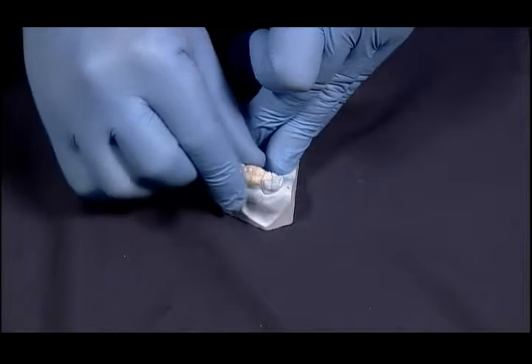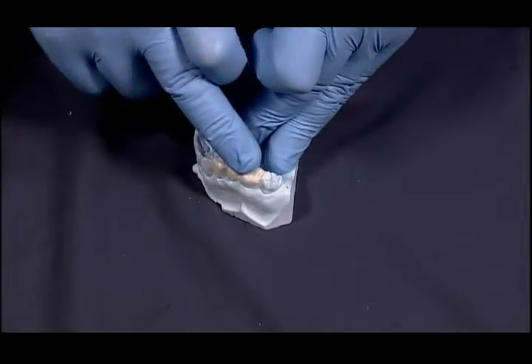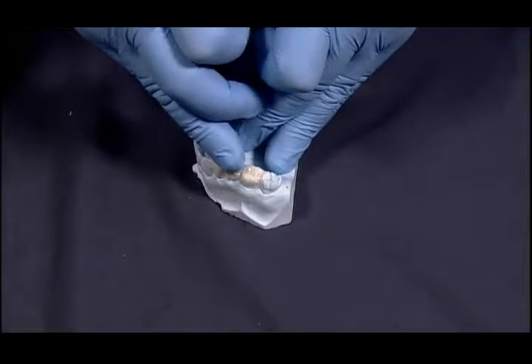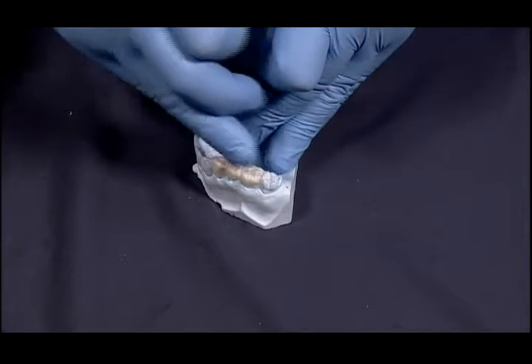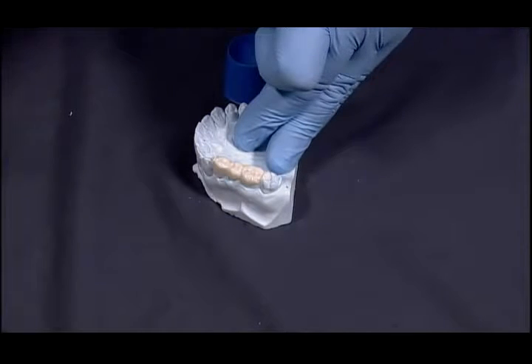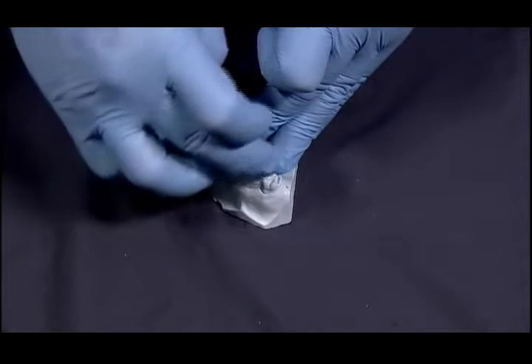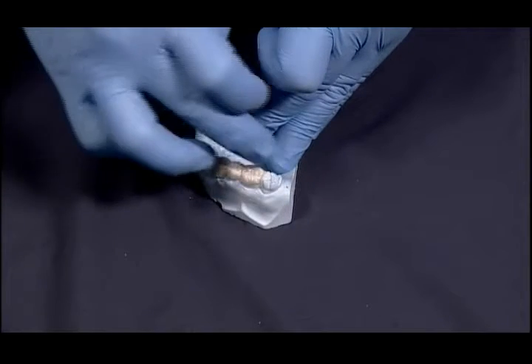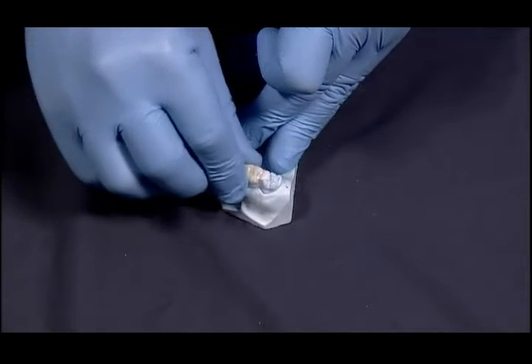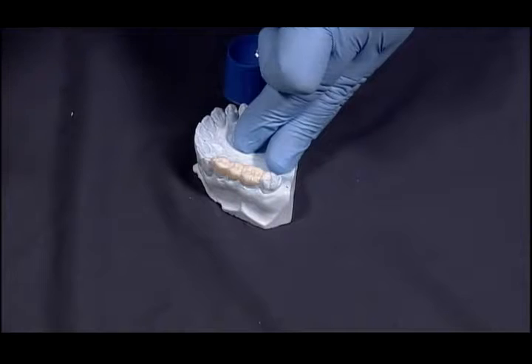And once you've done this a number of times, you'll just leave it sit, have the patient close completely into maximum intercuspation, and you will end up with a restoration that will be very close to an ideal occlusion this way. You let the material set to its full set after you had it on and off a couple of times, being sure that you're not going to lock into the interproximals.